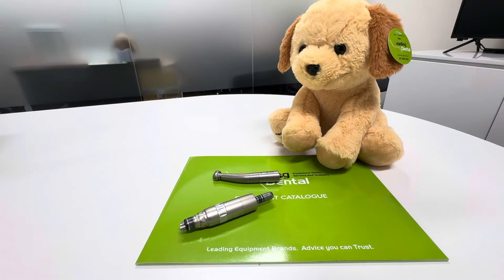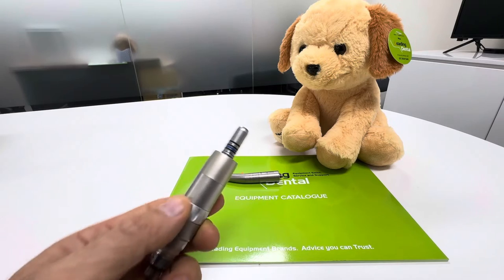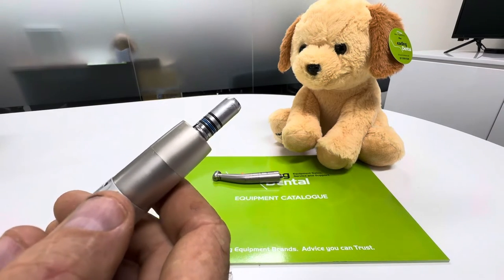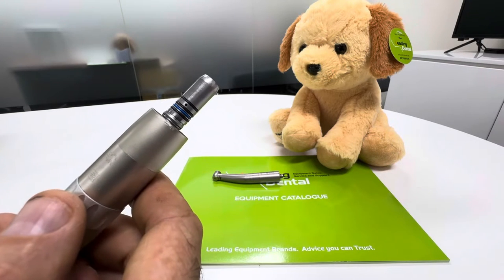Hi everyone, Steve here from Leading Dental — and that's Max in the back of the picture there, our latest puppy from Leading Dental. I just want to go through today where some of the o-rings are on motors — on the low-speed motors and also on the NSK high-speed handpieces.